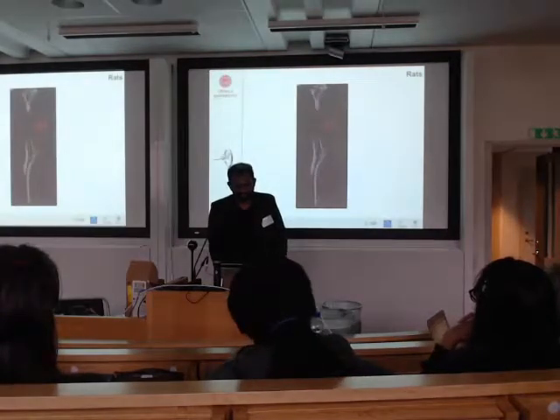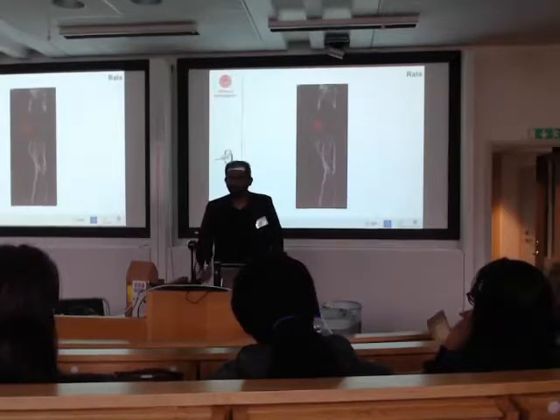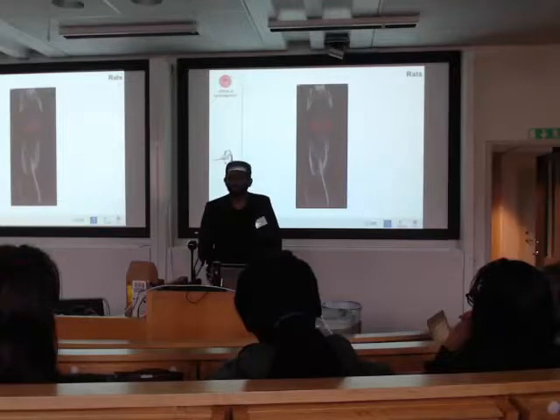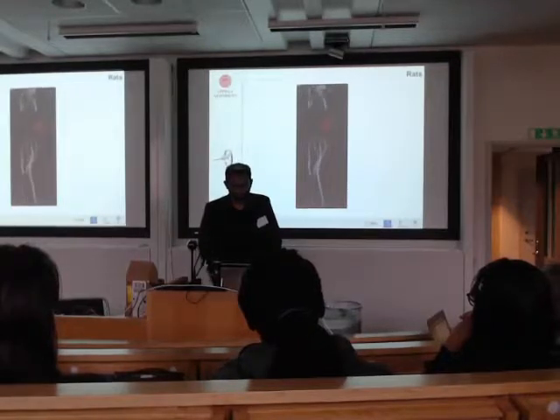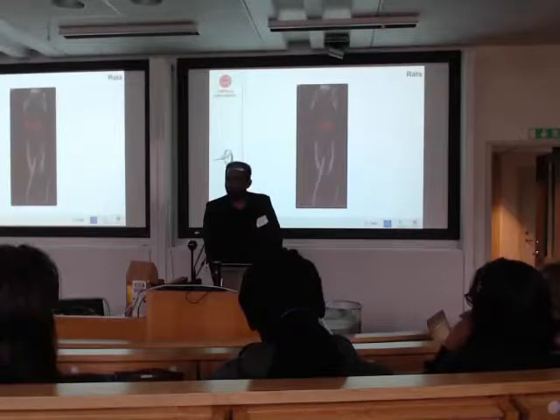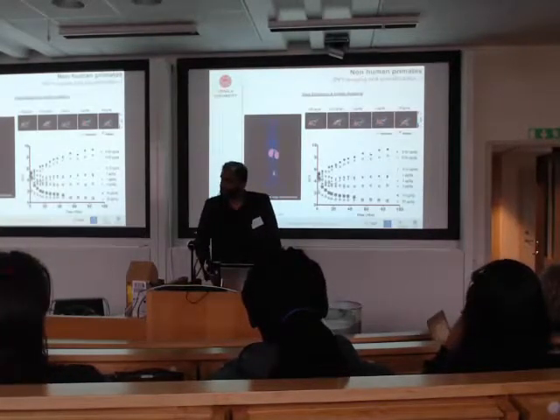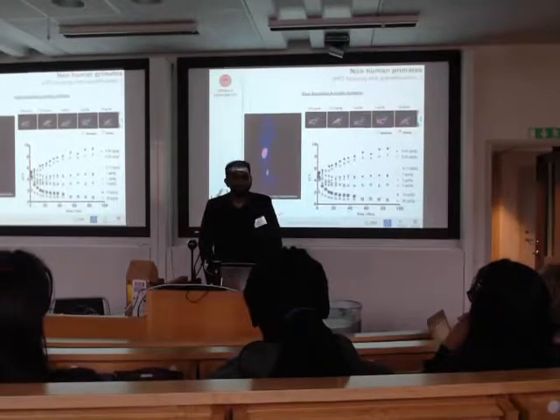But still, since the pancreas is close to the kidneys and this tracer is secreted via the kidneys, it was hard to visualize the pancreas. If I forgot to mention in the beginning, the aim of the study was to visualize these islets of the pancreas and then to quantify them. All right. So, yeah, the team had a lot of money, so we did studies on monkeys, cynomolgus monkey models.